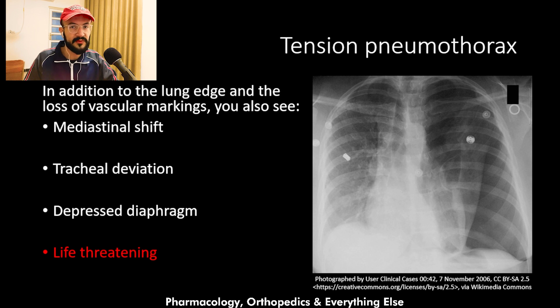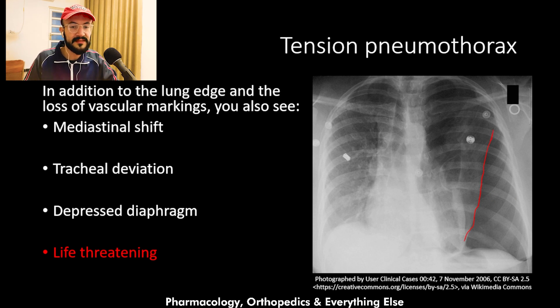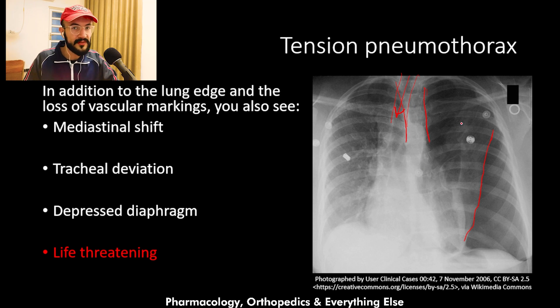This is a frontal chest x-ray of a tension pneumothorax. You can see the lung edge going down here, and beyond it there are no vascular markings. You can also see that the trachea is deviated — the trachea runs like this next to the spine — and it is notably deviated to the right. The heart is also shifted, indicating mediastinal shift.